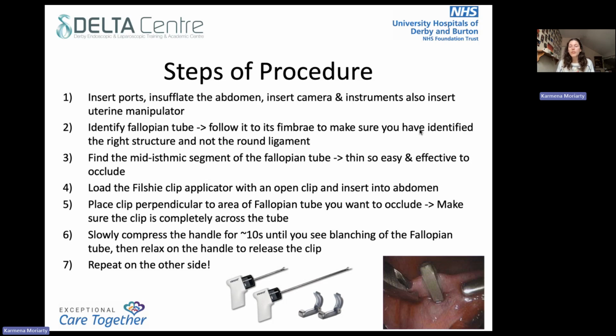Make sure that it's completely across the whole width of the tube, because if it's not, then there's a risk that this will fail and that there will still be part of the tube that isn't blocked off, and so the egg can pass through.